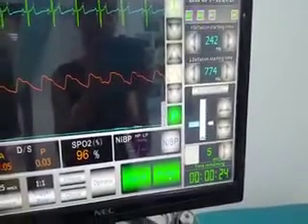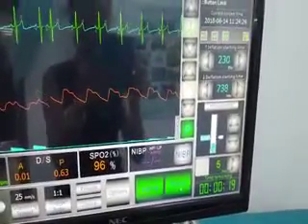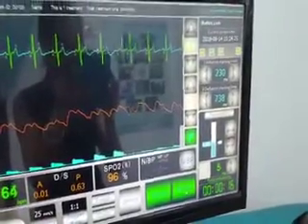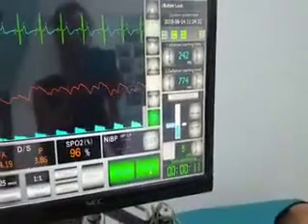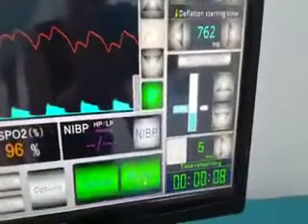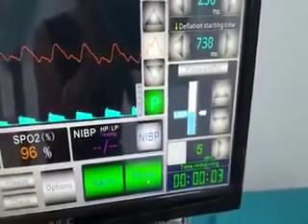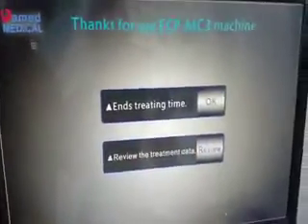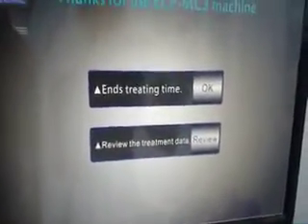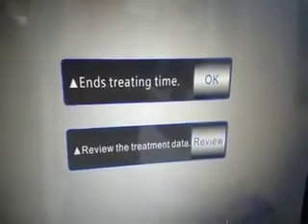We can stop treatment at any time in the middle if required for the patient. You can see there are only 9–10 seconds remaining for this treatment. The maximum treatment duration is 2 hours. When treatment finishes, you will see two selections: one is to end the treatment, and the other is to review the treatment data.